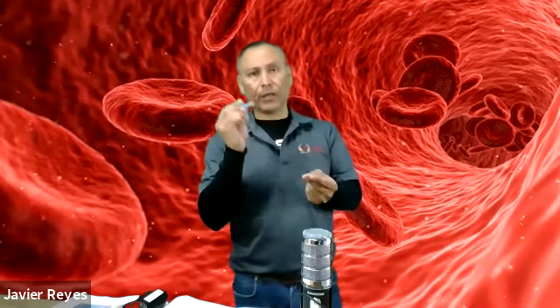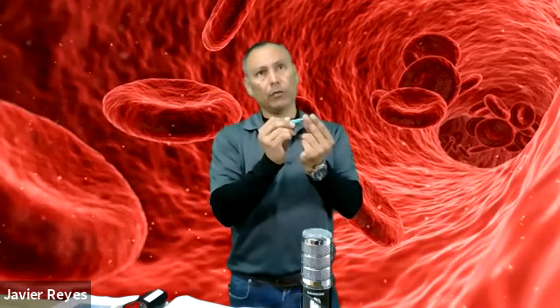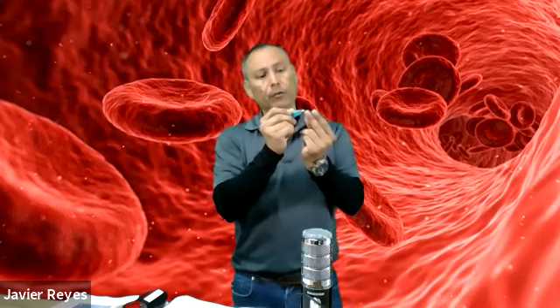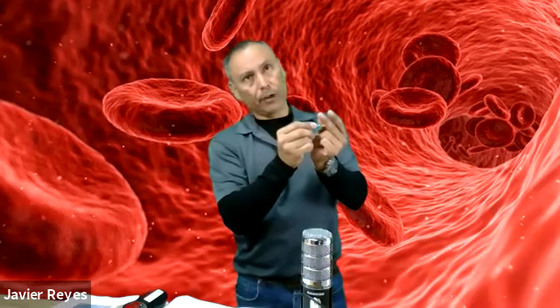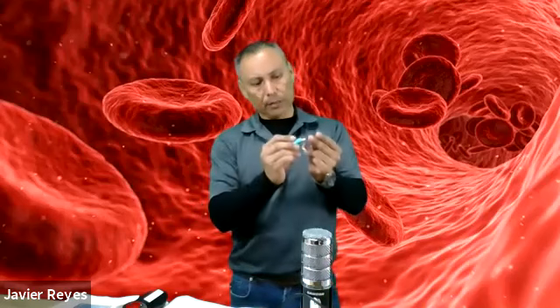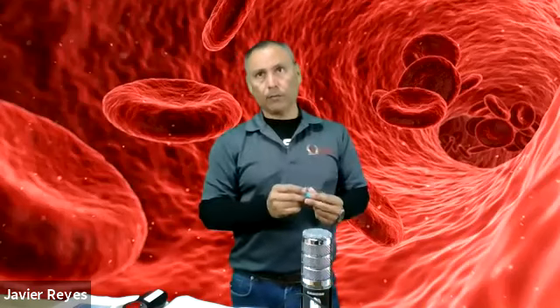Remember that your lancet device has to be perpendicular to the whorls of the fingertips. If you go vertical, your sample is going to smear down the finger and you will not be able to collect. It's going to be very difficult. So make sure it's perpendicular to the whorls or fingerprints of your finger.